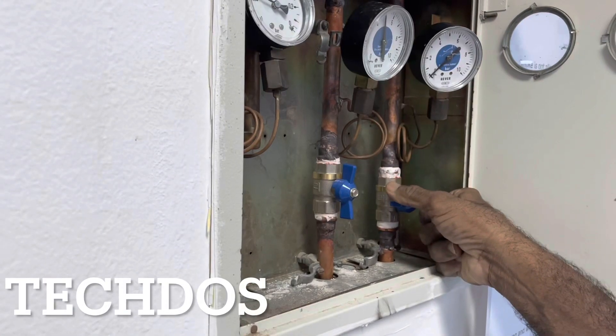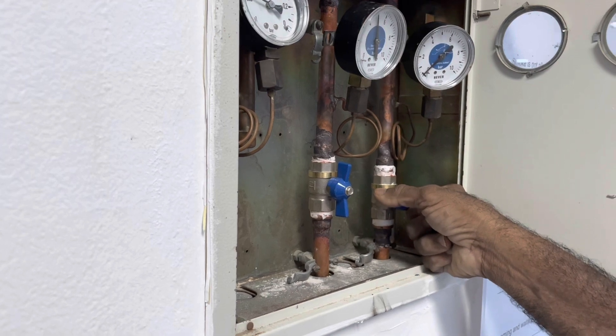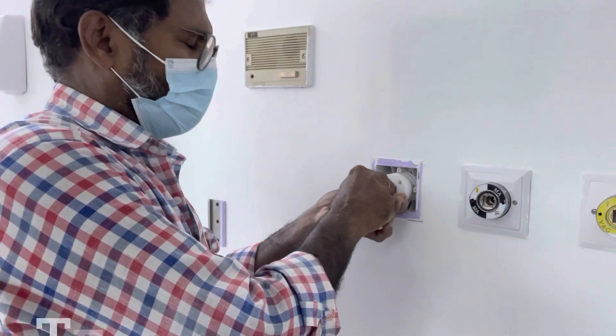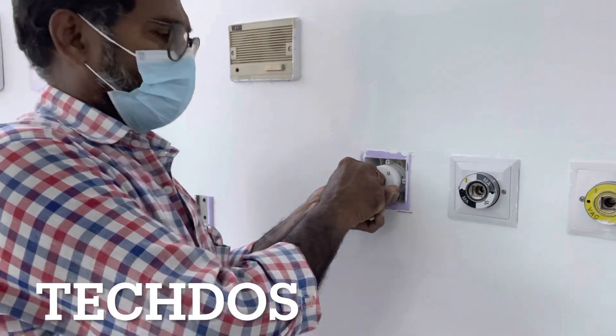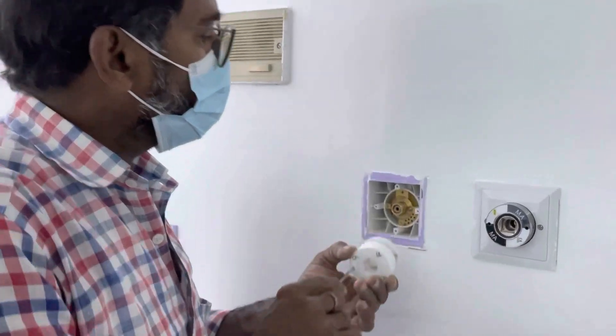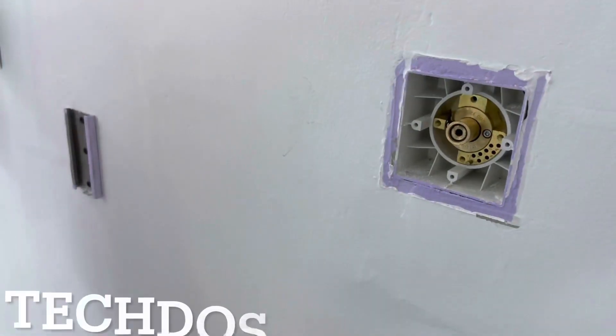First, close the valve to release the air. Then release the pressure from the outlet to remove it easily. Open the outlet to remove the cartridge.